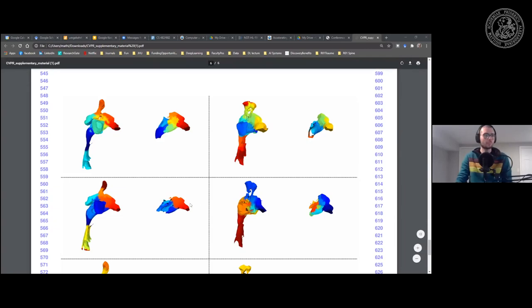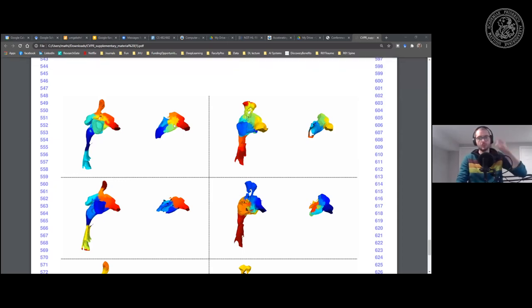So what would happen is, this is a sinus, as you would extract it from a CT scan. You essentially have the nostrils here, then it goes all the way towards the frontal sinuses up there, and then it goes down to the throat. This is essentially the full CT model that you can get from a CT scan. This is the model that you get using the algorithm that I showed, where you just have one quick scope into the nose towards the throat and back. And now you want to register this to that one.